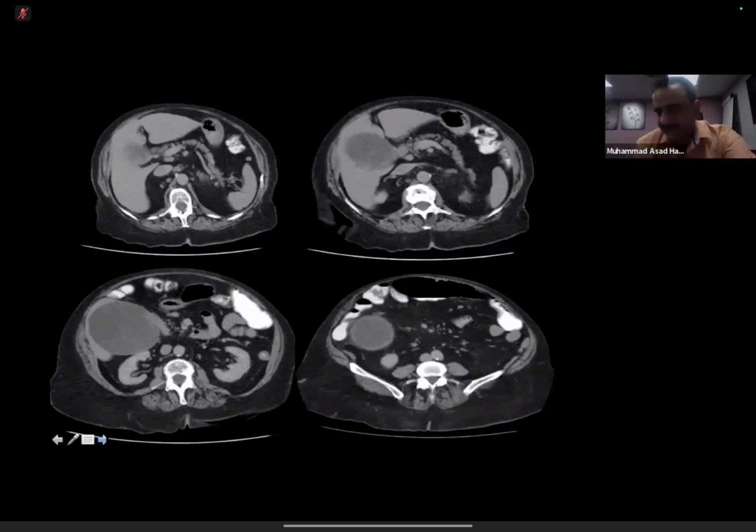On the other hand, if there is a big thick margin of liver between the skin and the gallbladder, you can go directly into the gallbladder. It used to be recommended because people used to say that there would be bile leak and the risk of biliary peritonitis. Having said that, the studies published have shown that actually that is not true.